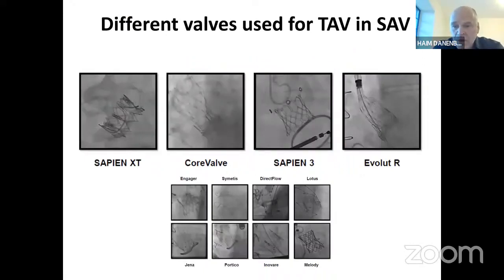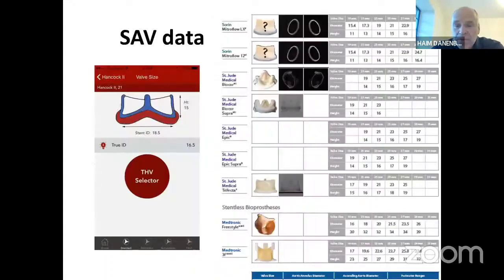And we, as interventional cardiologists, in recent years may treat the valve failure not by redo surgery, but rather with implanting a TAVR valve, a transcatheter aortic valve, and this may be either one of the balloon expandable, the Sapien, or the self-expandable, the CoreValve and its new generation, the Evolut or the Evolut Pro. Usually, at least in my center, we tend to go with the supraannular Evolut, since it provides us with better hemodynamics. Other valves have been tried as well, whether it's the MyVal, the Portico, and others. But we tend to go with the self-expandable and mainly the supraannular self-expandable Evolut.